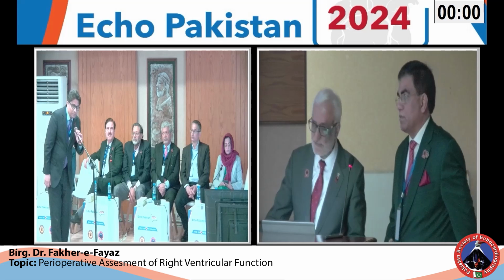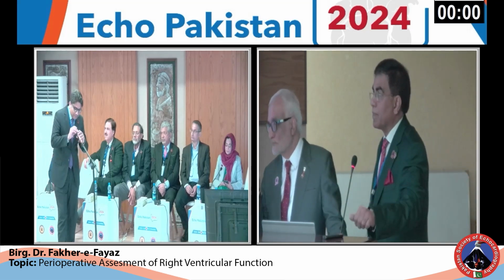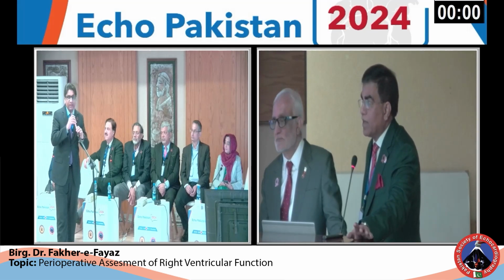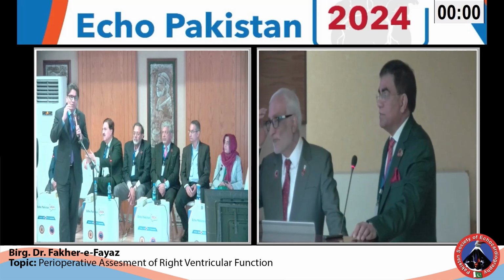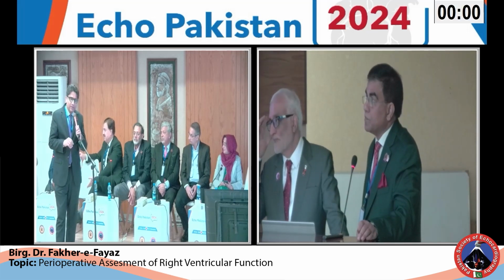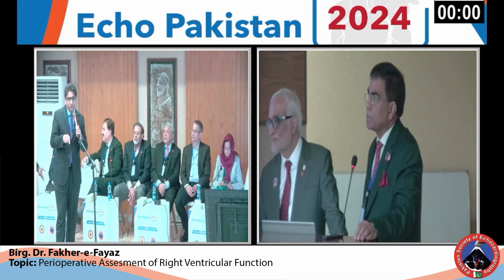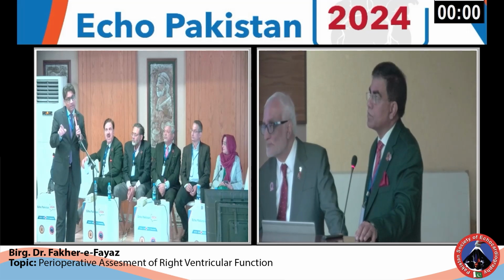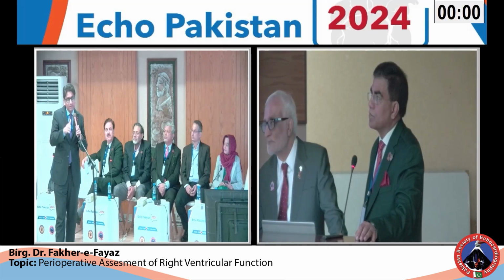Assalamu alaikum, sir. Sir, as you mentioned, the pulmonary valve is the most neglected valve in reporting and actually in echocardiography. This thing is missing basically. Missing. I just want to ask, sir, is there any association of RV-PA coupling and uncoupling in assessing the RV function, as you mentioned TAPSE and RV S' TDI, if they are still normal, but RV-PA coupling and uncoupling comes out to be stage 1, stage 2, stage 3 and stage 4 RV dysfunction, which is actually very important in the mortality of the patient.